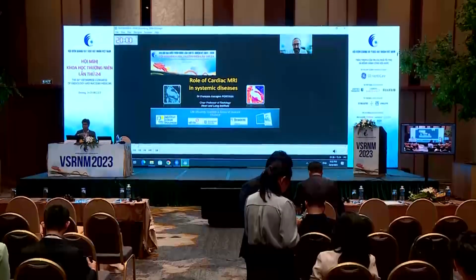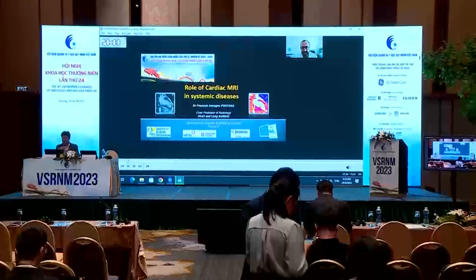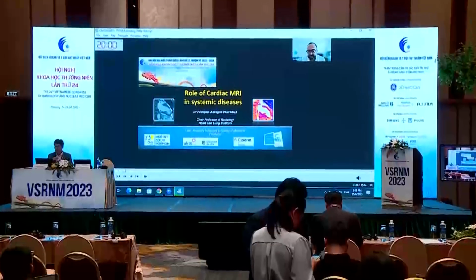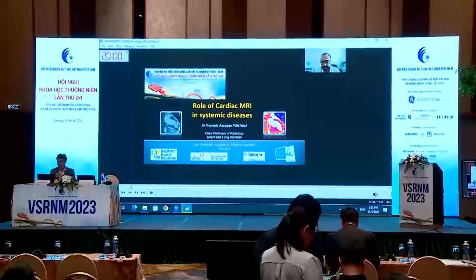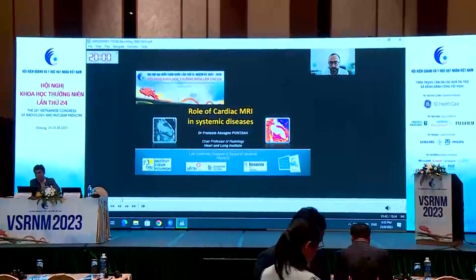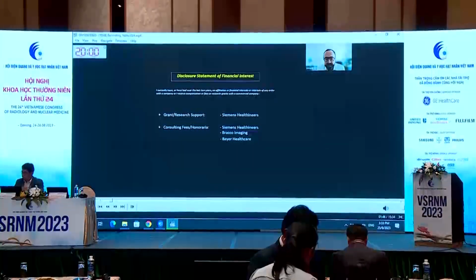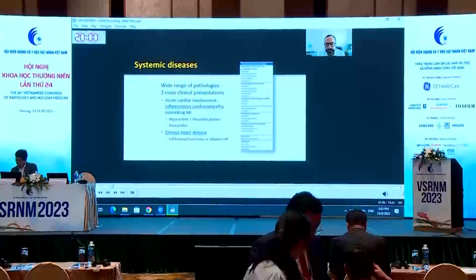So during the next 20 minutes, we will see together how to explore cardiac involvement in patients suffering from systemic diseases with cardiac MRI. These are my disclosures, and none of them are related to this presentation.